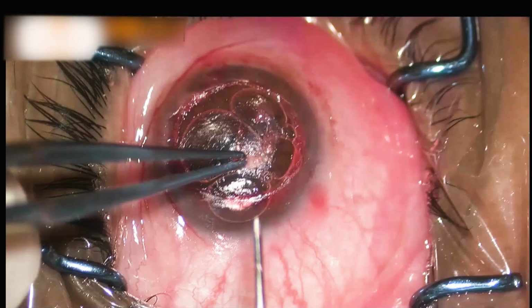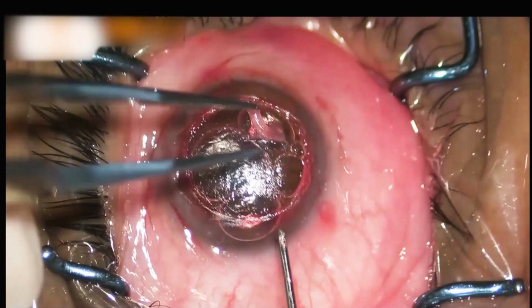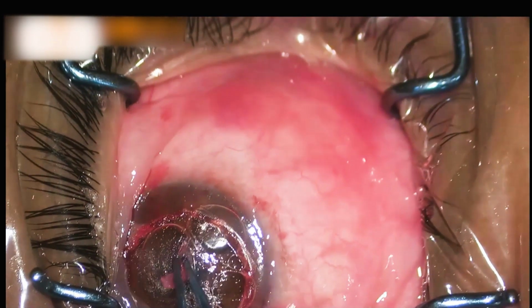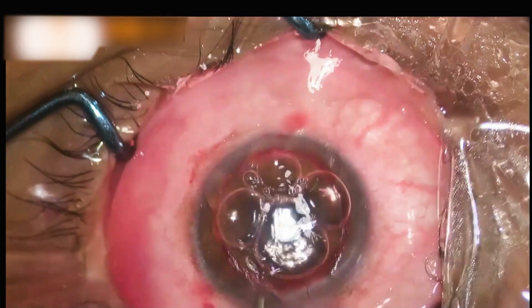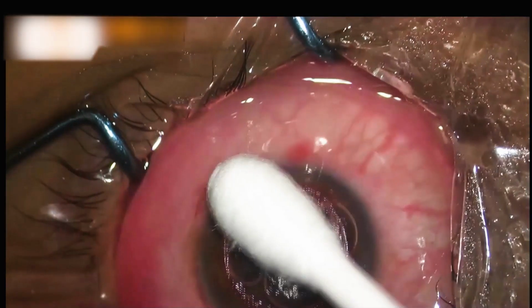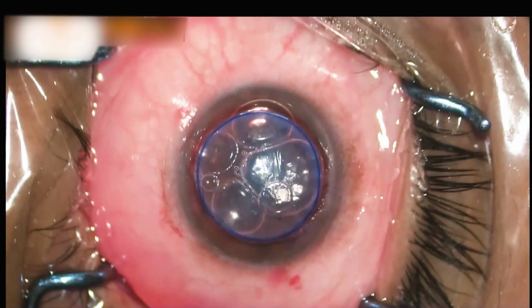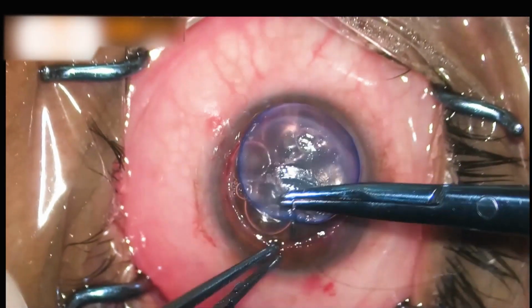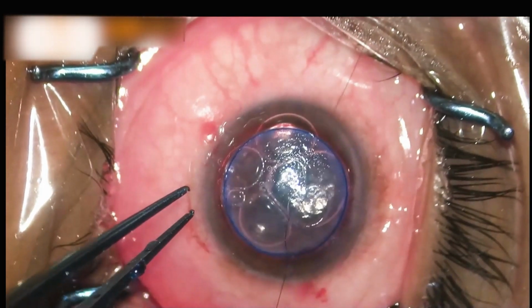A non-toothed forceps is then used to peel the stroma from the underlying predescemet layer. Stromal dissection is achieved till the level of the predescemet layer. A graft of size 7.75 mm whose Descemet is stripped off is prepared and placed over the host bed.